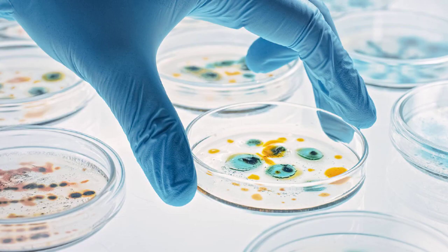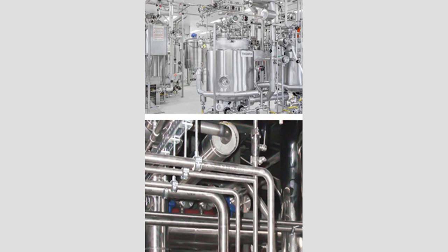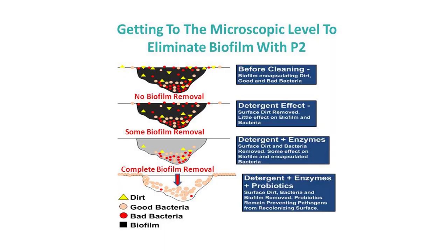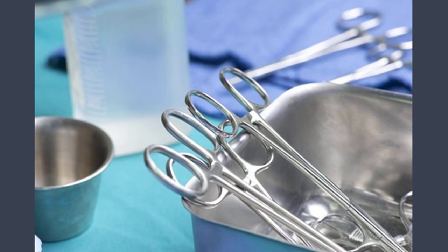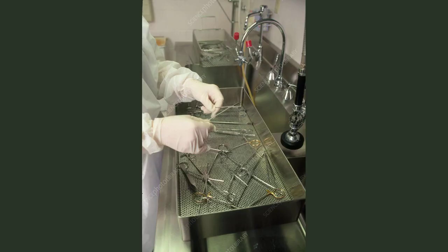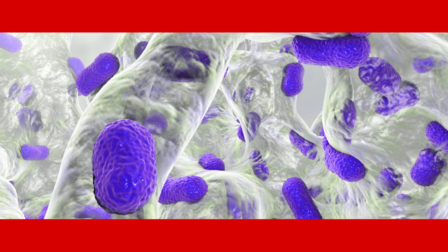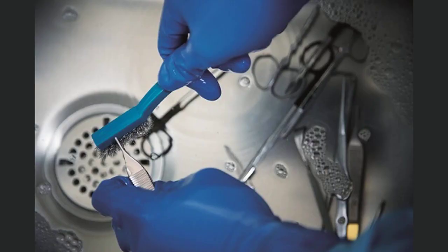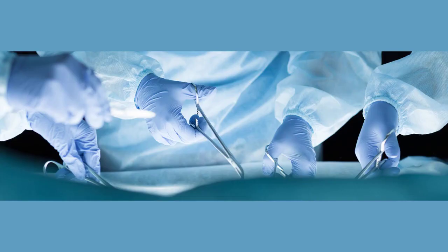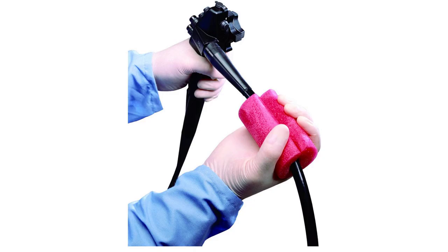It's similar to how leaving dishes in the sink overnight breaks down stubborn food residue. The key difference is they're doing it for sanitization, whereas regular people do it to avoid hand-washing their pots and pans. Afterwards, staff proceeds with manual brushing before moving on to autoclave sterilization. They should regularly cover the specifics of these processes and subsequent storage procedures to keep up to date. Routine audits can help with compliance and help them find any issues.